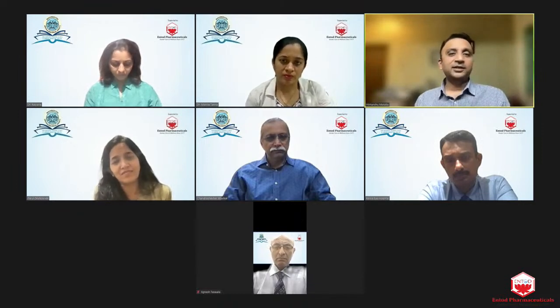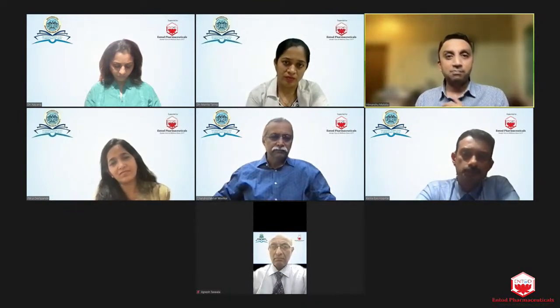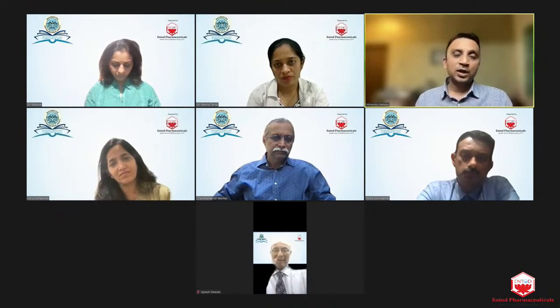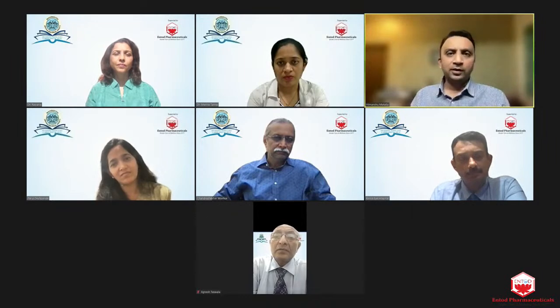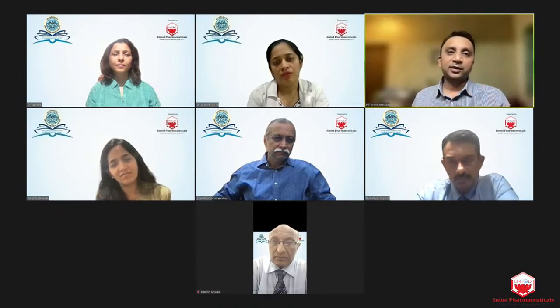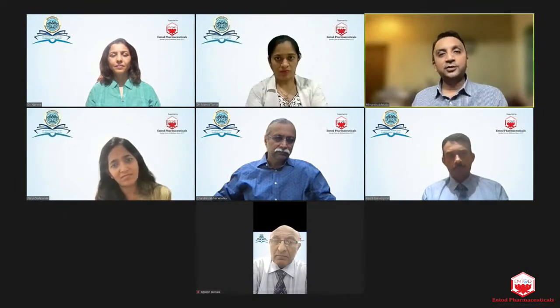So in such cases, flattening that inferior elevation alone would make the surface much more regular and give a much better spherical equivalent compared to anything else you use. Similarly with Intacs, if we are looking at cases where the axes are already flat, within your acceptable limit, and they still don't have quite steep K, where the spherical equivalent is not very high.